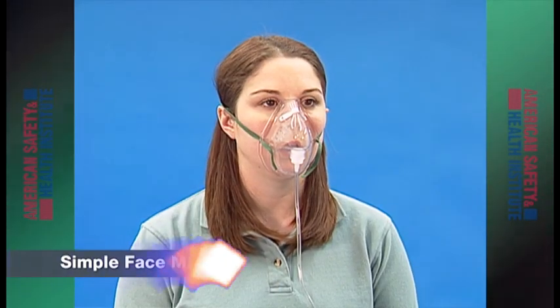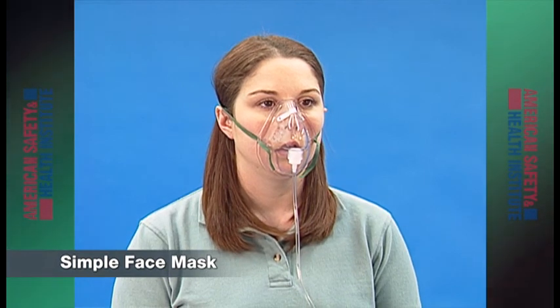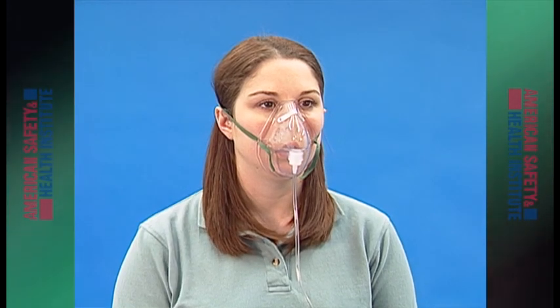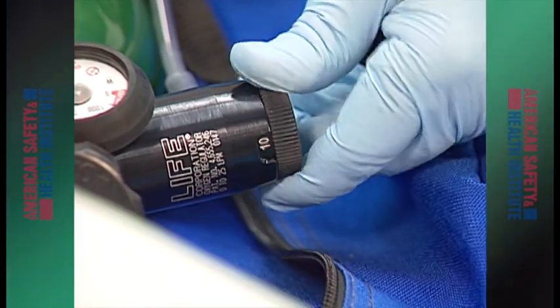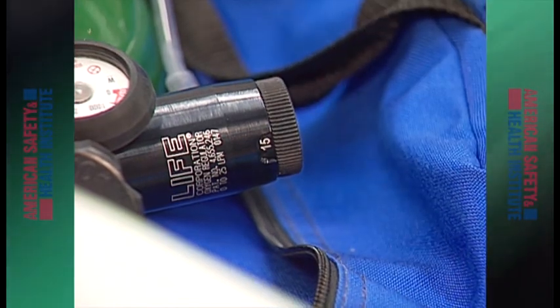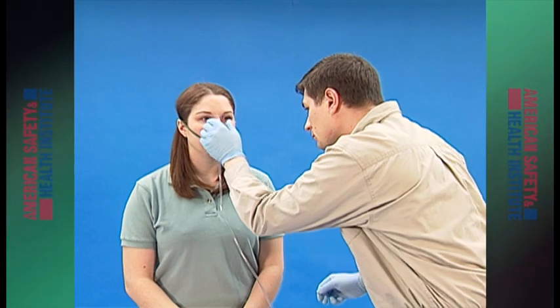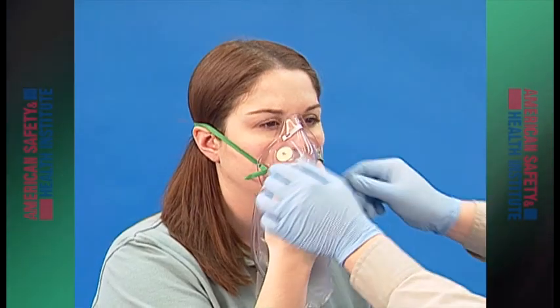A simple face mask is similar to a ventilation mask, except for the lack of a ventilation port. It also provides oxygen concentrations as high as 60%. Use the highest flow rate available, between 6 and 15 liters per minute. Make sure the mask seals well on a patient's face.